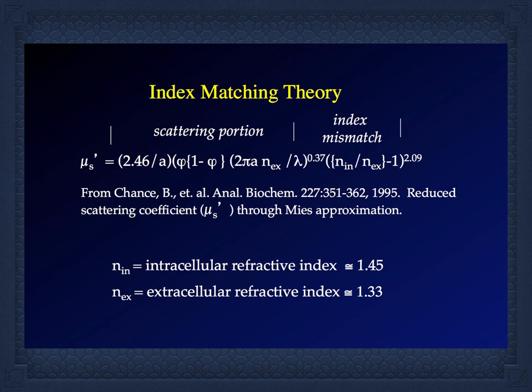So now, how do we image through blood? We can deduce this to some degree from the last image, but scattering theory. I want to caution that, in my opinion, scattering theory is only of very limited value in highly scattering tissue. But this type of analysis does give us sort of a guideline. Tissue is just complex and variable.